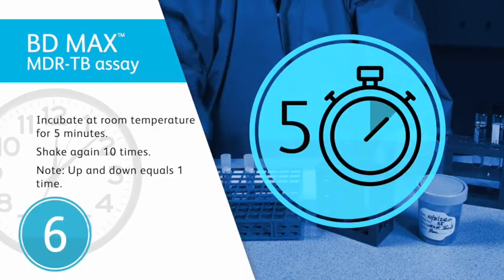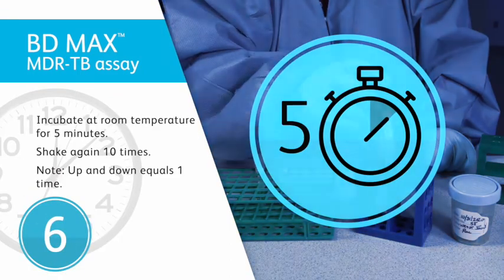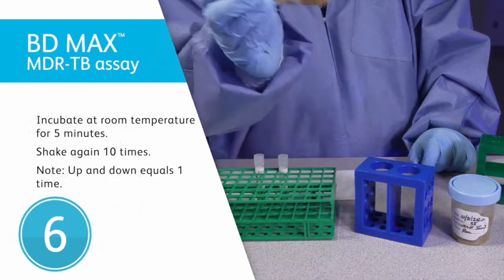Incubate the solution at room temperature for 5 minutes and then shake vigorously again 10 times.